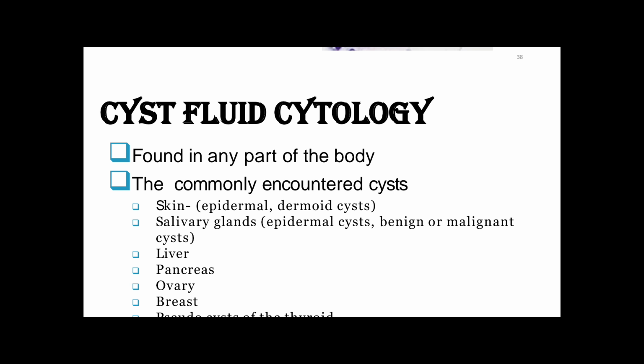The aspiration can be done as a diagnostic procedure or as a therapeutic procedure to drain the fluid.